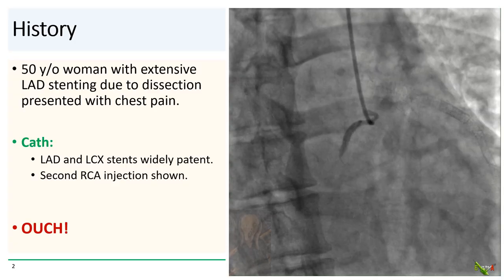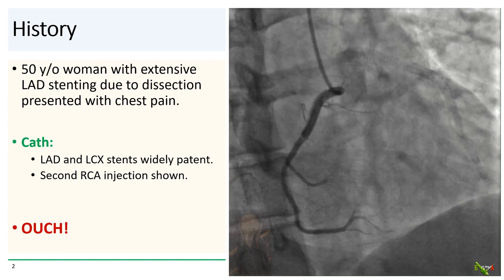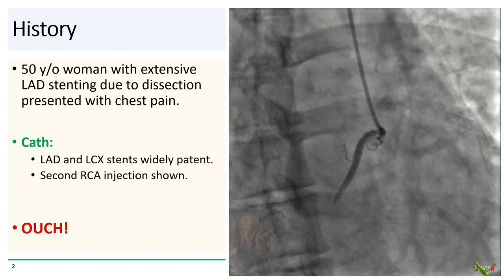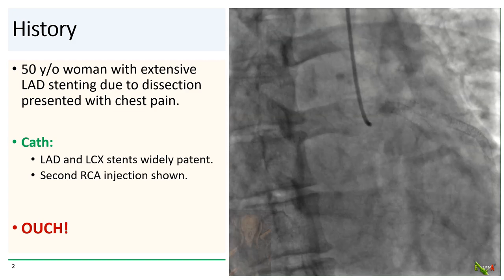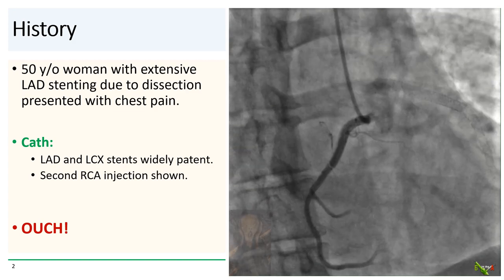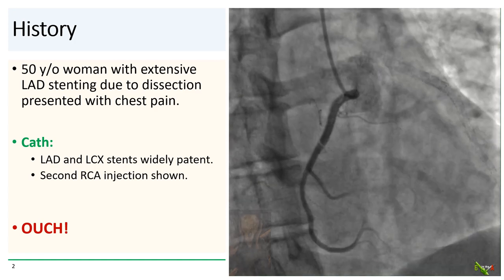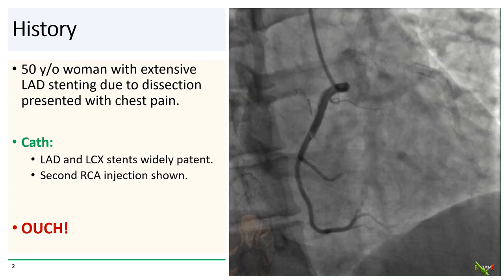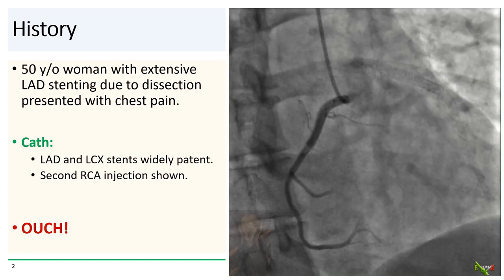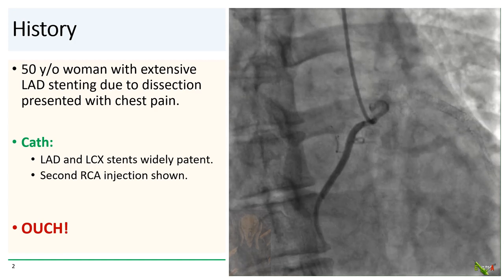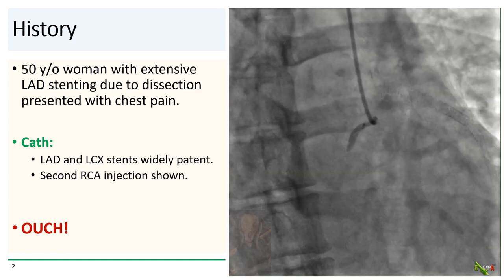We have a 50-year-old woman who presented with chest pain. Her past medical history is notable for extensive stenting of the LAD due to a dissection. On cath, her extensively stented LAD is widely patent and her circumflex stent is patent as well. The initial LAO injection of the RCA showed only mild to moderate osteal disease.